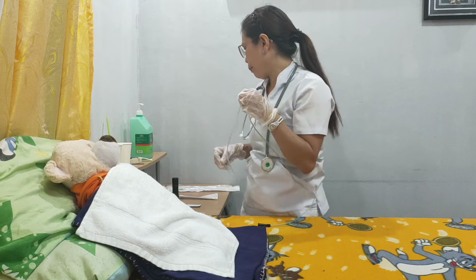Then right after this, I will mark this using a marker or a piece of tape, because measurement ensures that the tube will be long enough to enter the client's stomach.